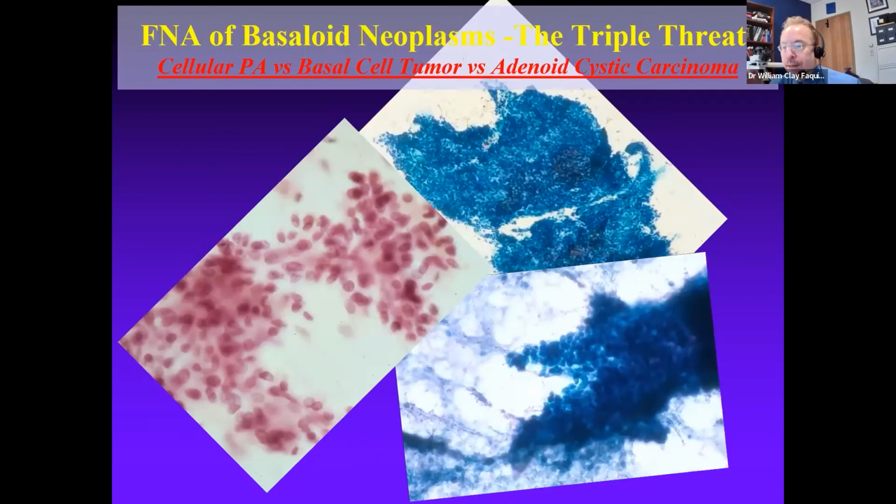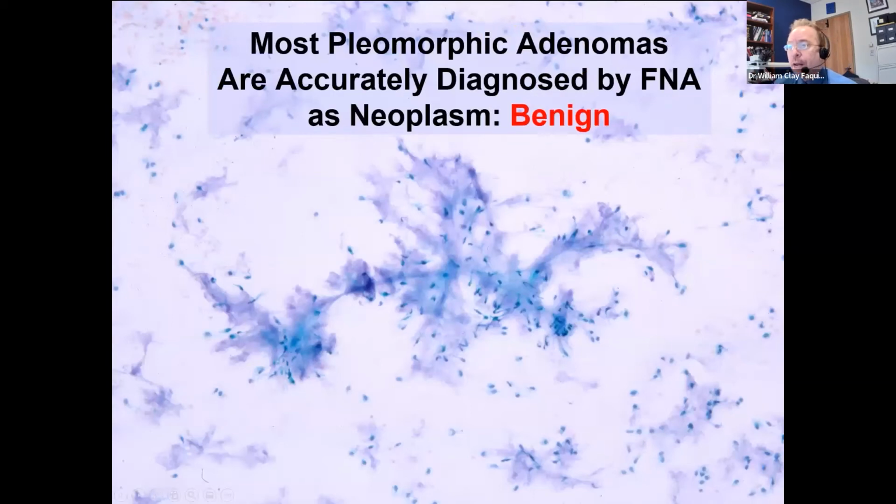So I just want to take you through a few of these different salivary gland tumors. One of the differential diagnostic considerations that gives us a lot of trouble are the basaloid tumors. And these include the cellular pleomorphic adenoma, the solid adenoid cystic carcinoma, and the basal cell tumor. As I've already alluded to, we're very fortunate because a large percentage of salivary gland tumors, especially those in the parotid, are going to be pleomorphic adenoma.